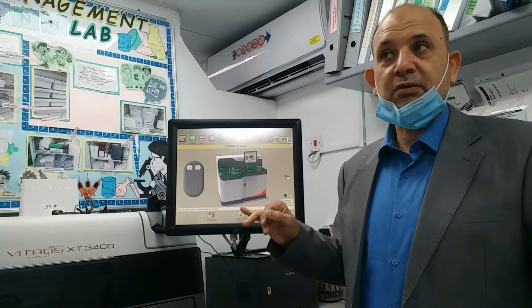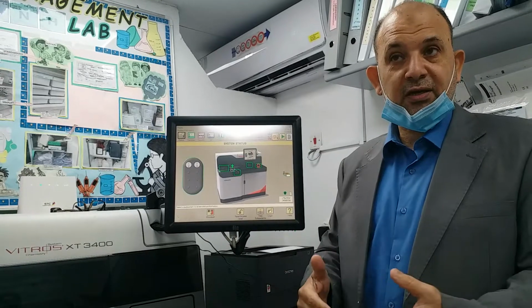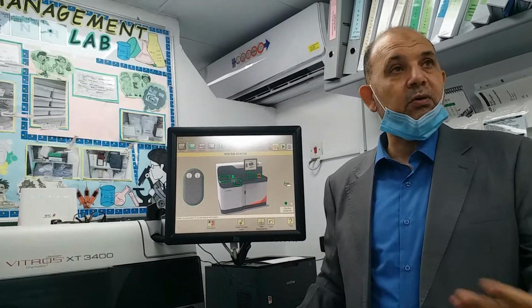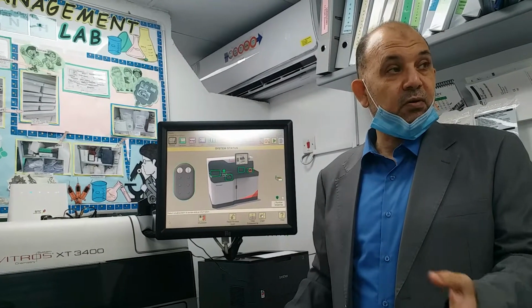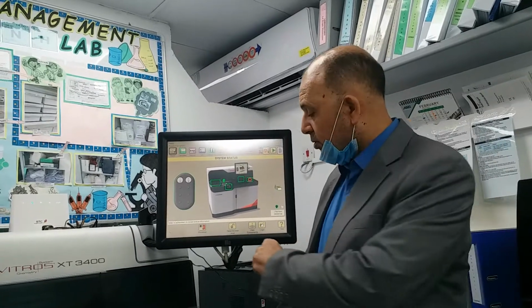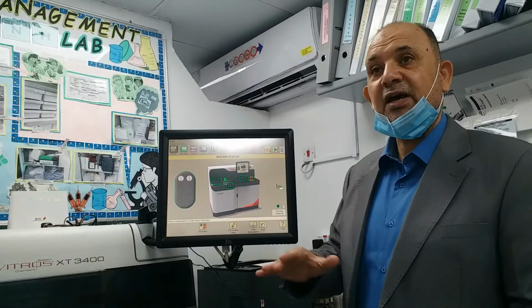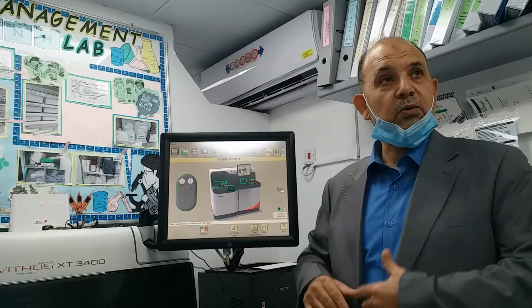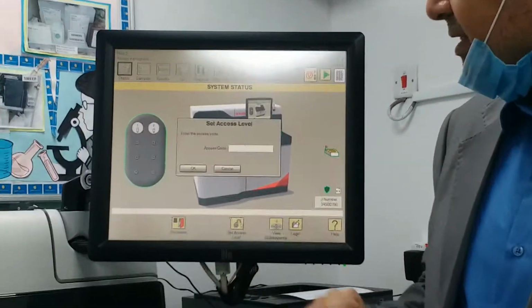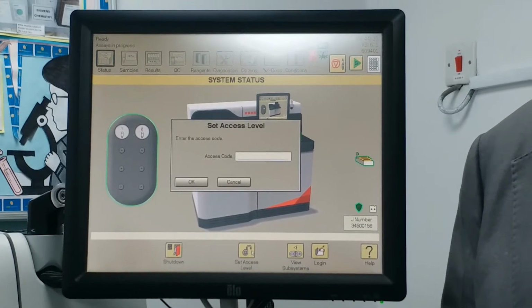The regular option, without any additional password, is only for the regular tech. Or you can choose supervisor or administrator on the system, or instead of administrator it should be engineer. So I click on that one, and automatically it escapes from here. That means I have no tool to go through the higher level of the instrument. Again, I press it, and it asks me for a password.